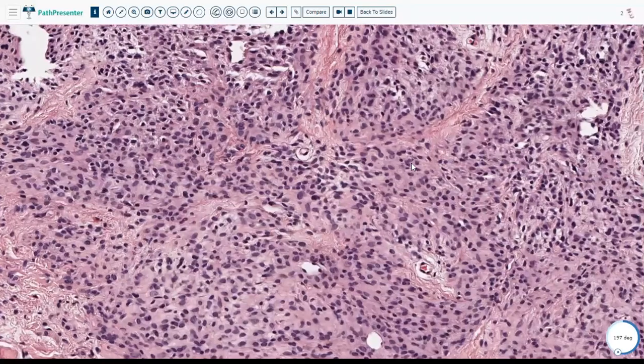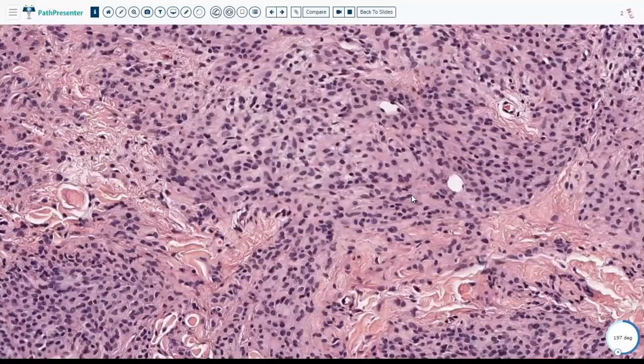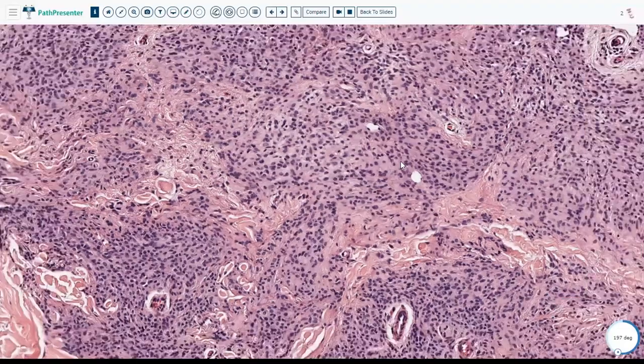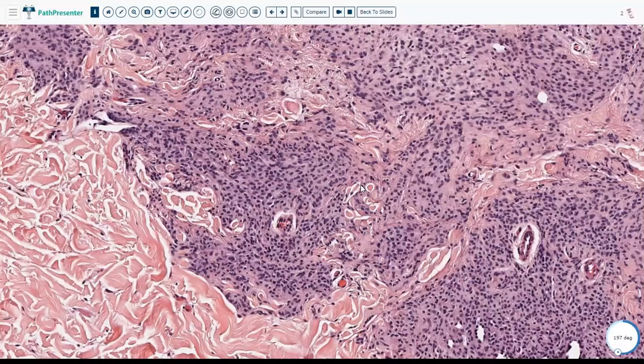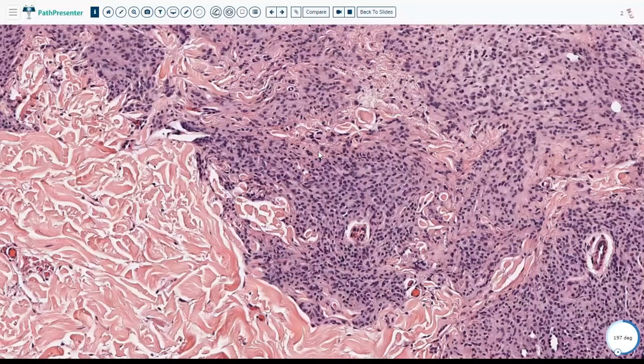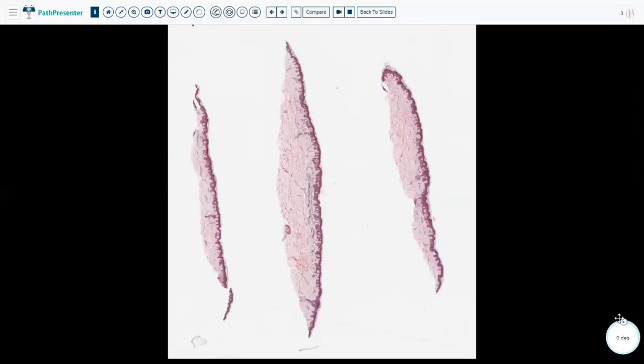Another feature important to note is the absence of mitosis, especially in the deeper layers. If you find any mitosis, that's a feature that should make you a bit concerned. And in this one, you don't really see anything. So moving on to the next lesion.